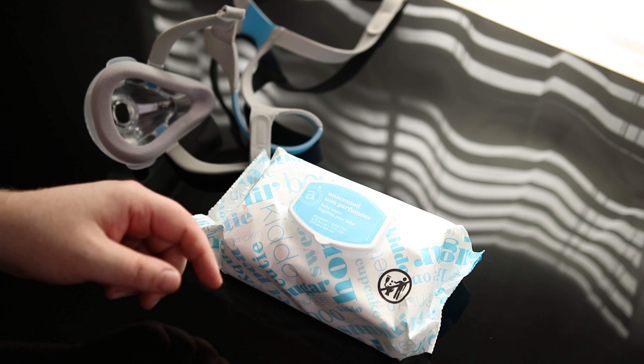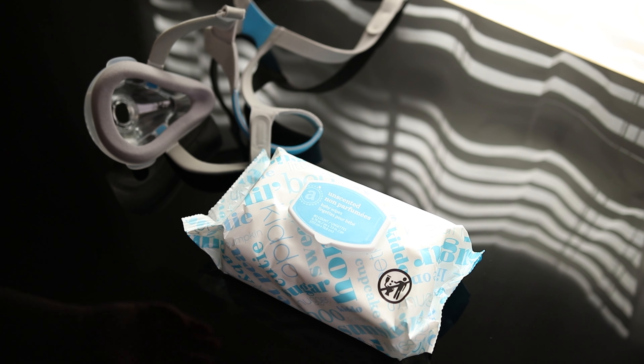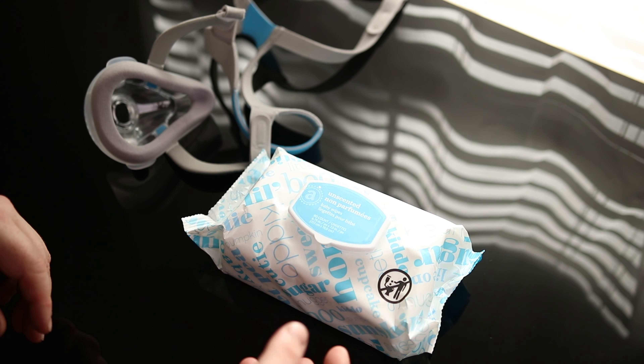I'm going to be using the unscented Amazon Elements Baby Wipes to clean my CPAP mask. It is important that they be unscented because you don't want anything going in there and then affecting your sleep.